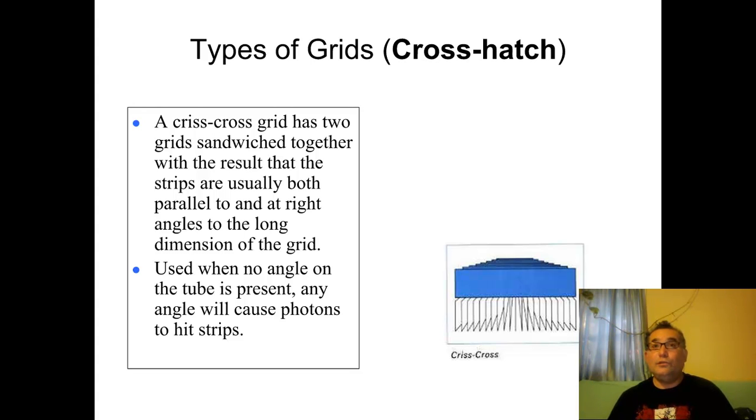Okay? If the tube is angled, or if the grid is angled, in other words, the grid that might be right underneath the patient, who is in a bed not on a hard surface, very possible for that grid to tilt underneath the patient.